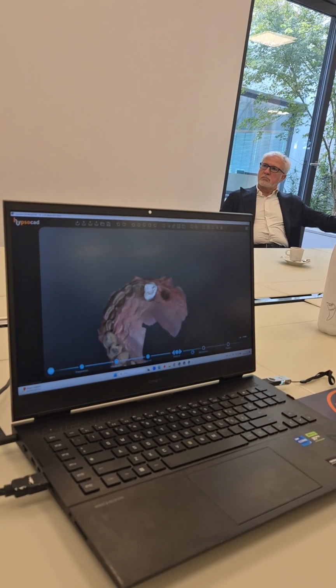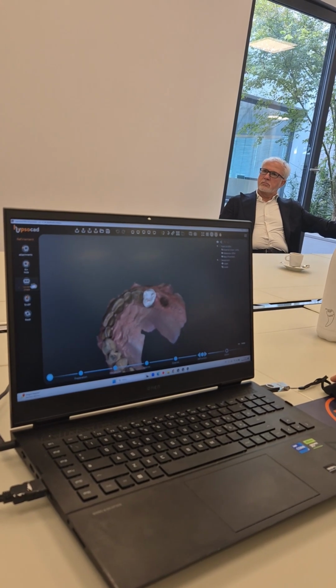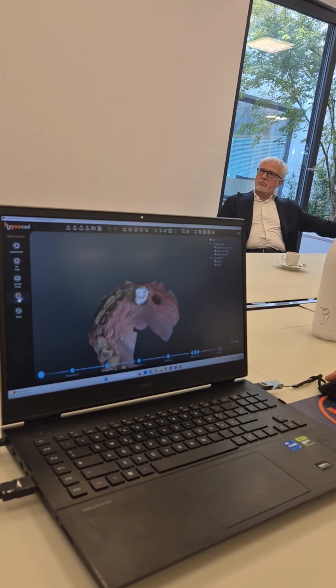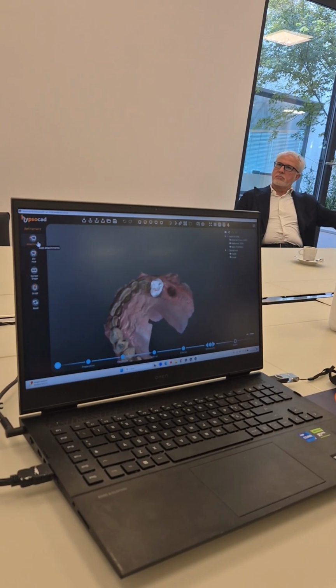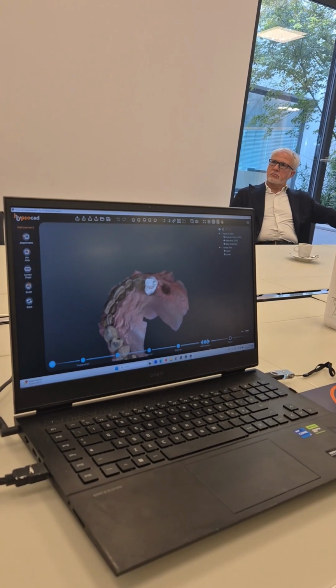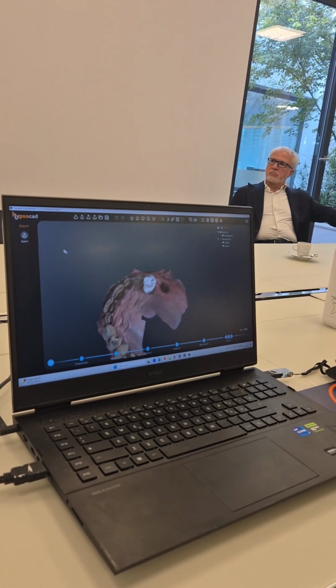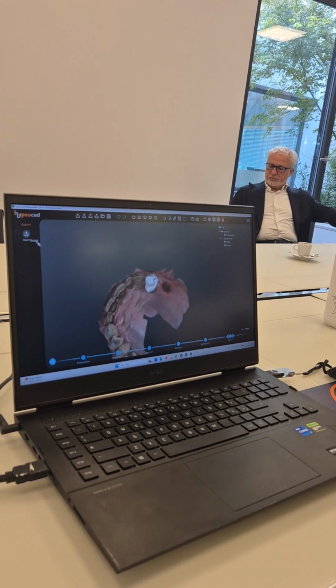After that, we can move on. The refinement step is a check. For example, if we want, we can model again the crown, or if we want, we can add the attachment inside the prosthesis, the crown, or we can move on and we can decide the correct folder to save this crown, okay?